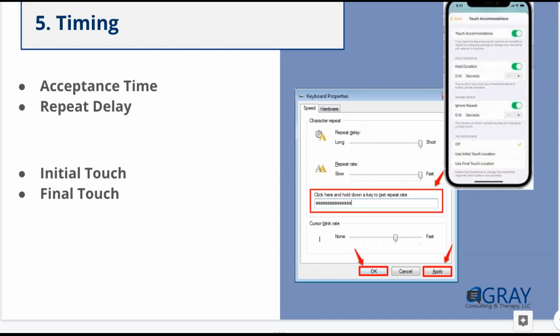So I really think of my role as like an efficiency expert. And so I'm always thinking like, okay, is this the fastest way? Our AAC users out there are already slowed down comparatively. So let's make things as efficient as humanly possible. So the repeat delay is only as large as I need it to be successful. And for me, successful is not 100% accuracy, because I know I trip over my words all the time.